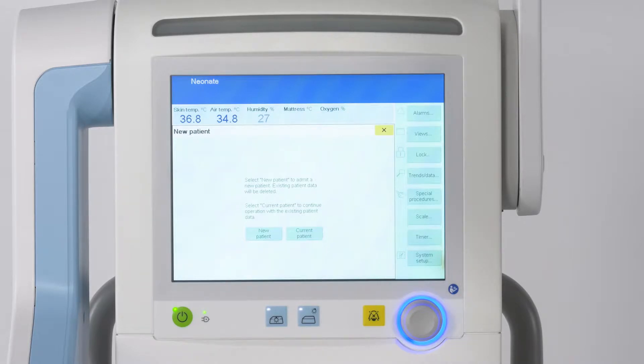If the device has been switched off for more than two hours, all existing patient data will be deleted. If the device has been switched off for less than two hours, the following dialog window is displayed. By touching the New Patient button, all existing patient data is deleted. By touching the Current Patient button, the device continues operation with all existing patient data and the most recent settings.